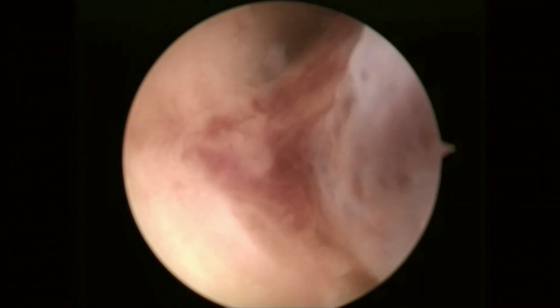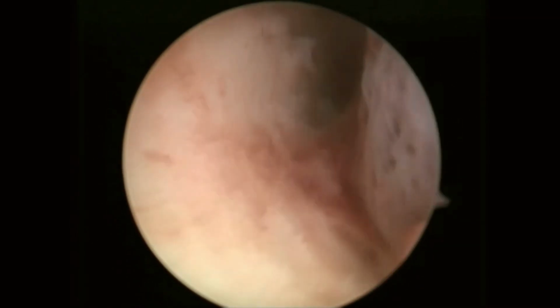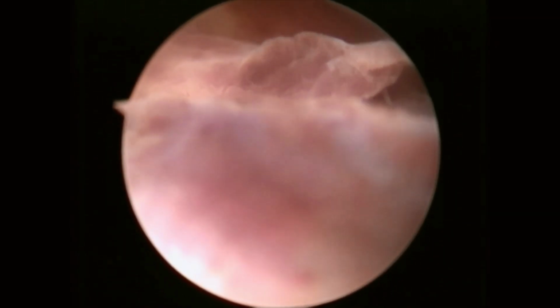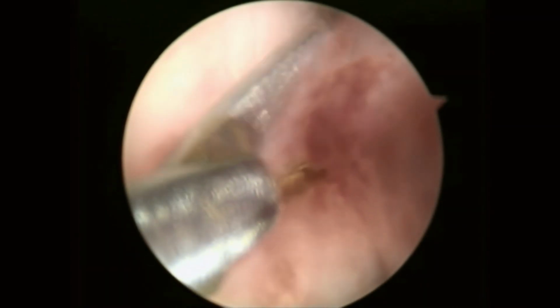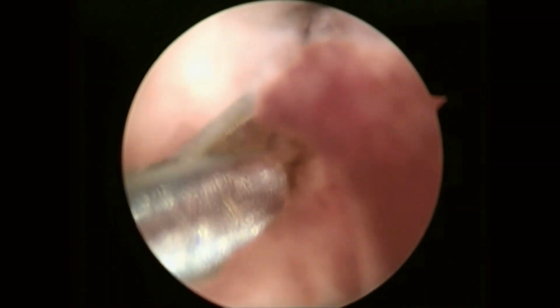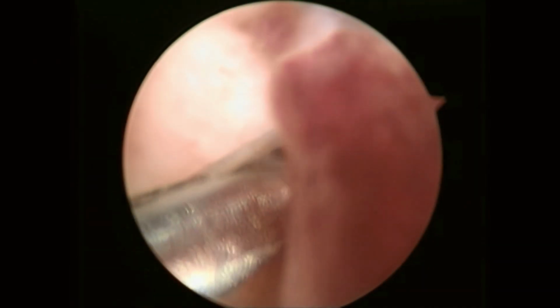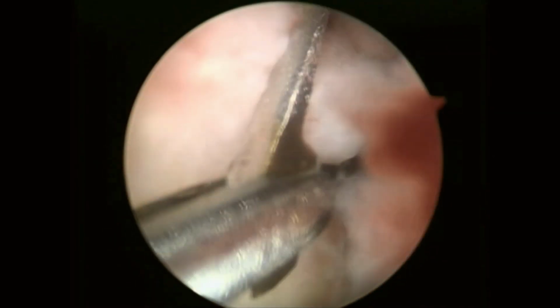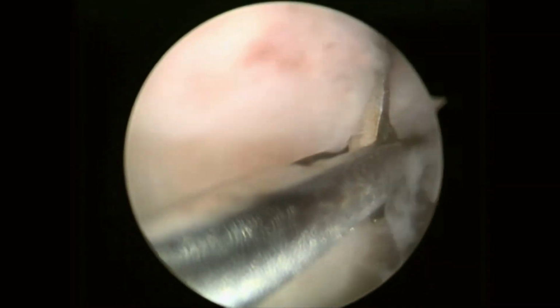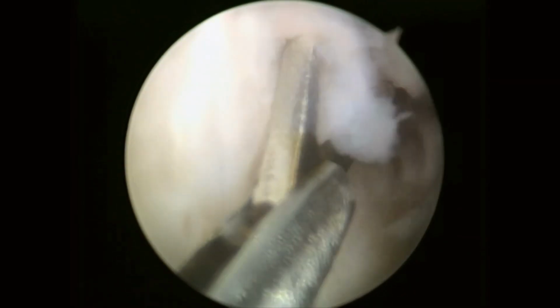So in this case, just to show, initially we used to do this because we used to cut the stalk. This should not be done nowadays due to advancement of the hysteroscopic instruments. Now with availability of bipolar resectoscope, there is a very good chance of removing these polyps by resectoscope. Here the polyp has been cut from the base.